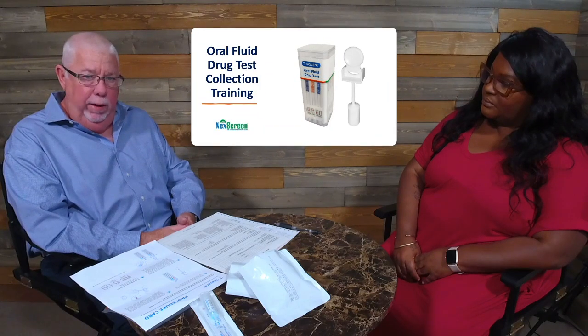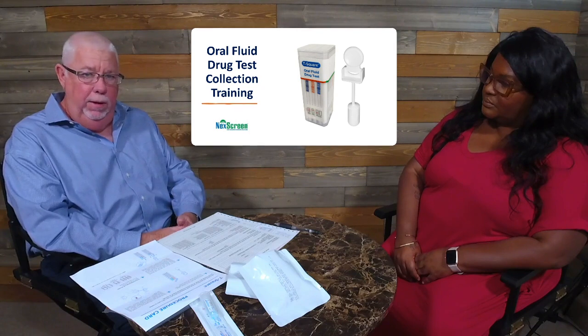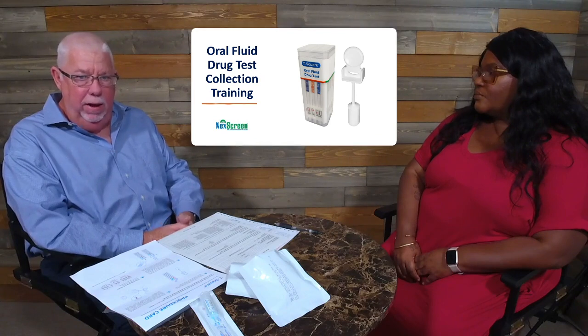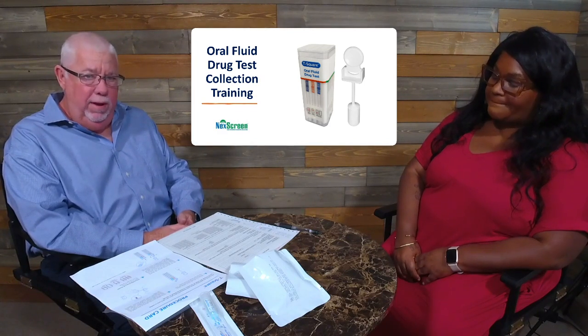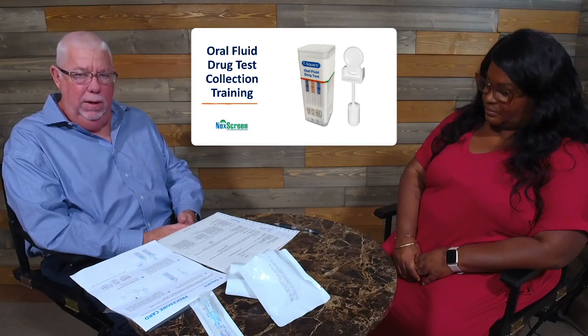If it's non-negative or inconclusive, we'll do a second oral fluid collection with a second device, to send that second device out to a laboratory for confirmation testing to get a conclusive drug test result. So with all instant drug testing, a negative result is conclusive, it's accurate. But if it's not negative, it's called inconclusive, and it needs to go out to the lab for confirmation testing. When we're doing oral fluid testing, we need to collect a second oral fluid specimen to send when we need to do the confirmation testing at the lab.